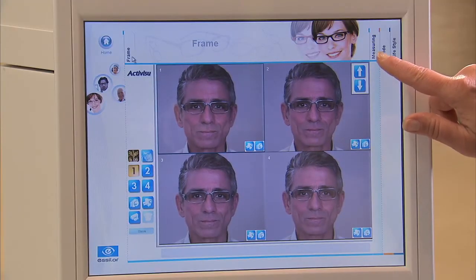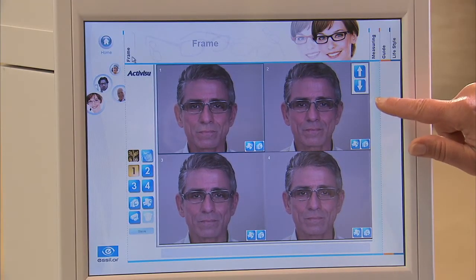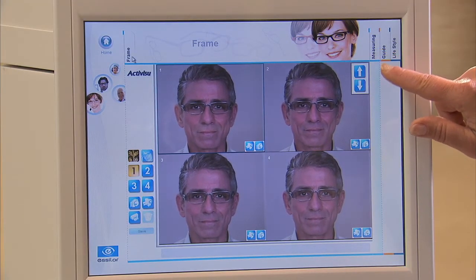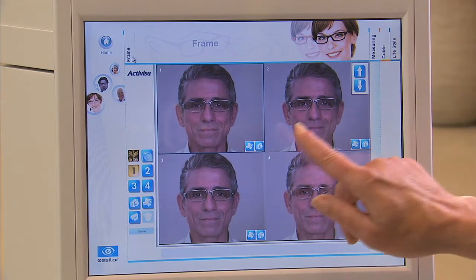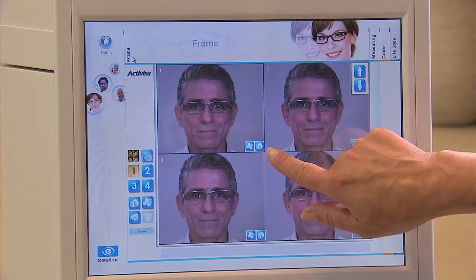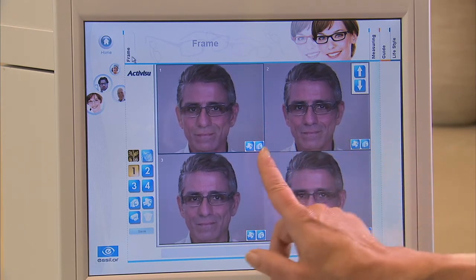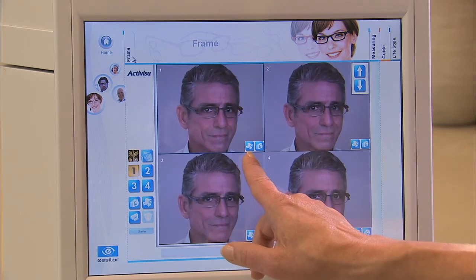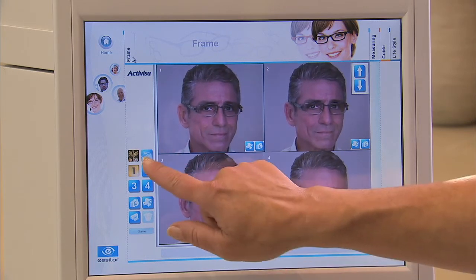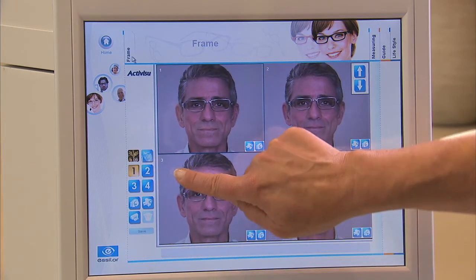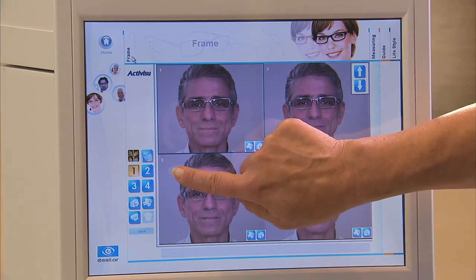You can raise or lower the camera using the arrows on the right. To take a single picture, click on the camera icon. To take a short video, click on the video icon. You can display from one to four images by clicking on the number buttons on the left.